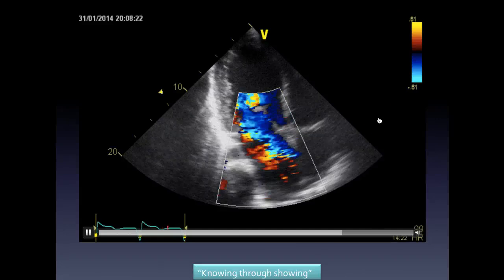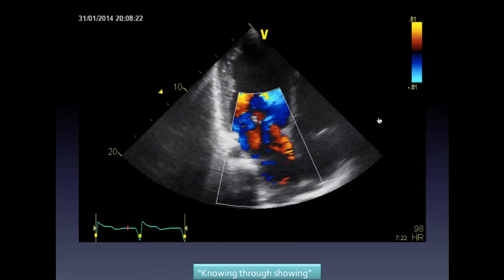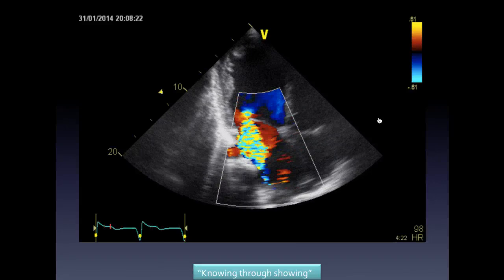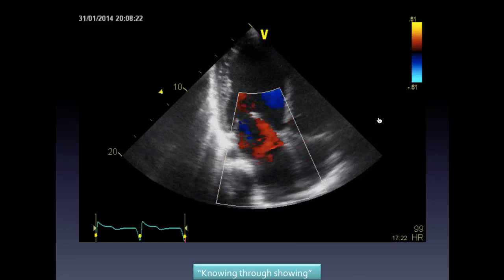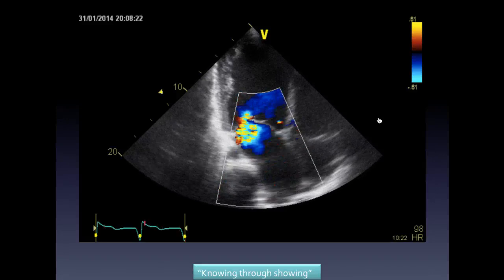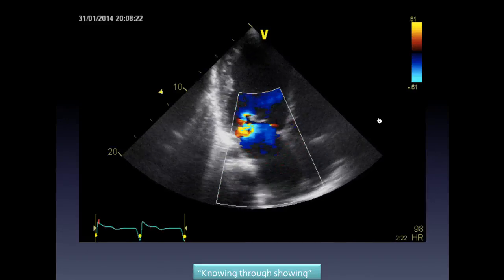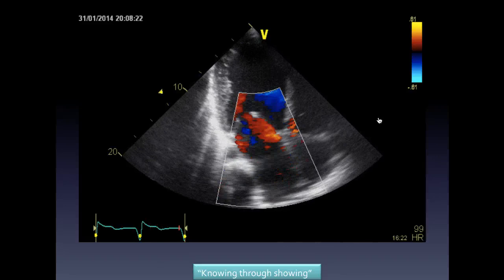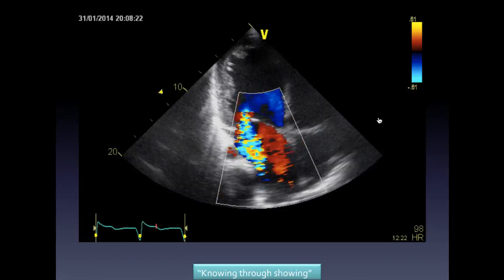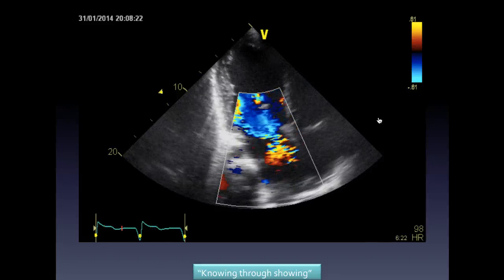And what's at least moderate mitral regurgitation would look like torrential mitral regurgitation. Okay? I'm only just using that as an example to say that the settings in the machine have a profound effect on what you see and what you interpret. And unless you look at lots and lots of normals, you can really get yourself into trouble. However, this guy has at least moderate, and again, estimation of mitral regurgitation is at all times semi-quantitative, at least moderate mitral regurgitation. And in this case, his valve is actually structurally sound.